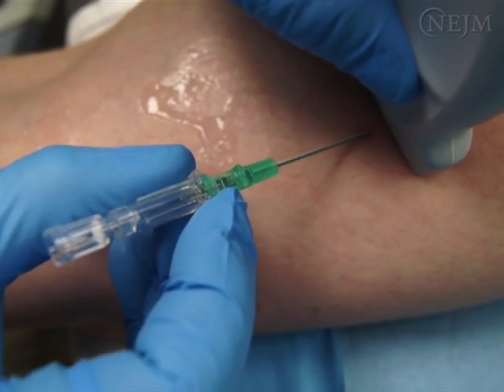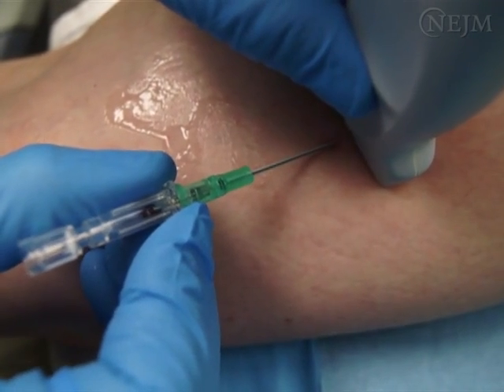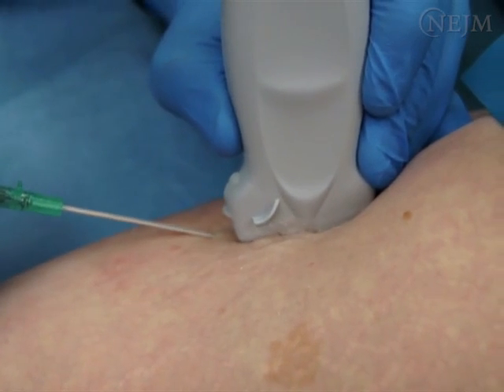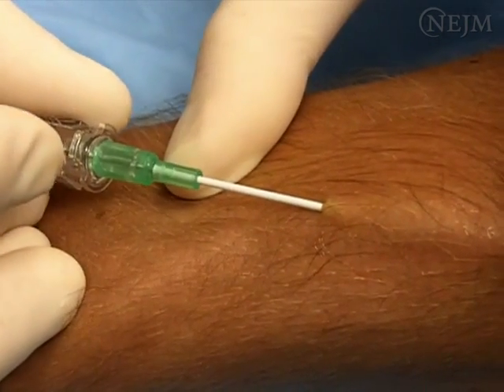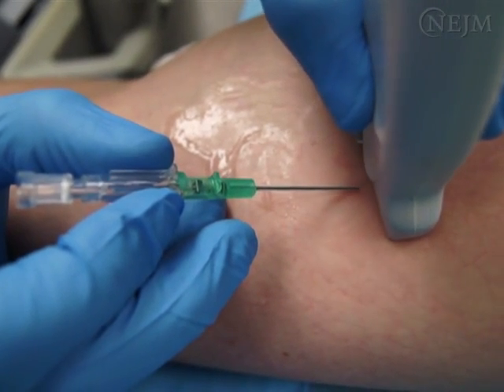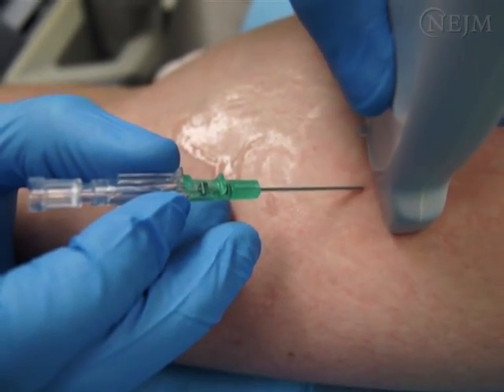It is reasonable to use ultrasound guidance after 2 failed attempts at standard IV catheter placement, and it may be best to use ultrasound guidance immediately if there has been a history of difficulties with IV access in the patient. We will review the proper technique for standard IV catheter placement and then demonstrate ultrasound guidance. We will limit our discussion to the upper extremity veins, but the same techniques can be used to cannulate any peripheral vein.